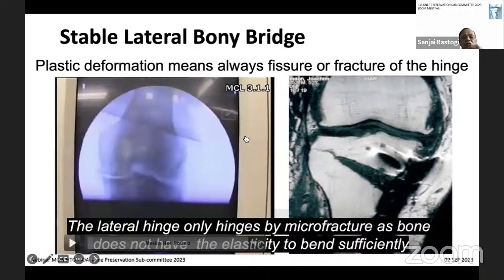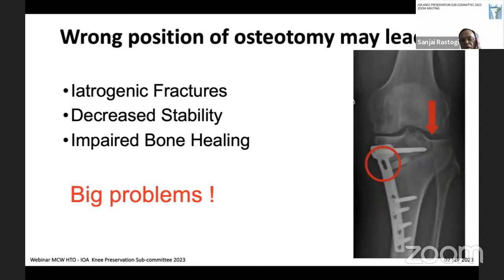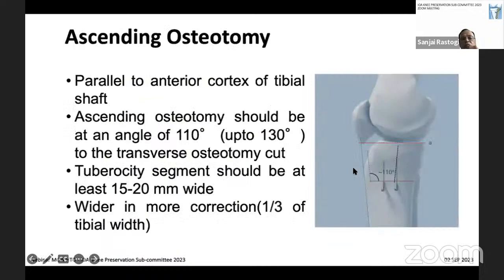The lateral bony bridge is a hinge. It has micro fractures, and the bone is not elastic. So micro fractures take place, but if they enter the joint, it leads to instability and impaired bone healing, which becomes a problem, and it takes more time to heal. The posterior cortex should be cut completely, because if it's not cut completely, it leads to plateau fracture or unstable lateral hinge and increase in tibial slope.